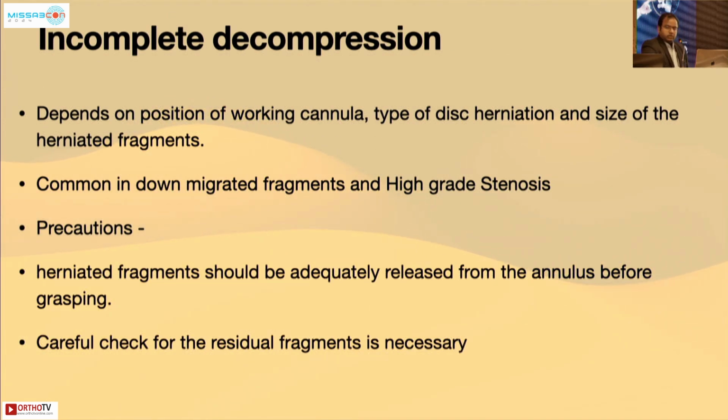So as Dr. Shrikant sir has told, decompression is very much important in stenosis. It depends on the position of your working cannula, type of disc herniation, and size of the herniated fragments. Mostly incomplete decompression is common in down migrated and high grade stenosis.